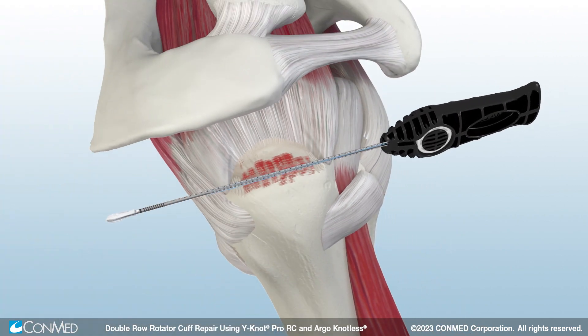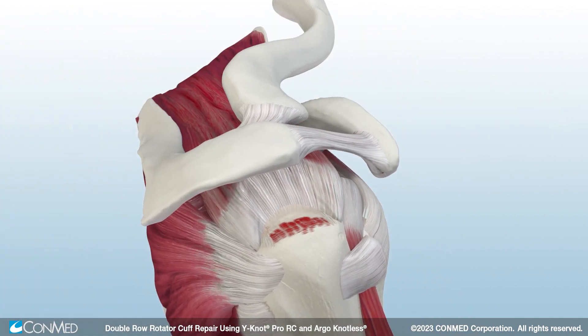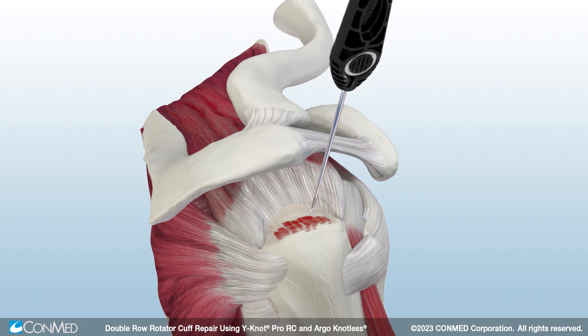Then, insert the Y-Knot ProRC with tape past the primary laser line. Pull back on the cleatless Pro handle to remove the driver. Then, pull back on all suture strands to set the anchor firmly beneath the cortex. Remove the sliding number two suture from the anchor.